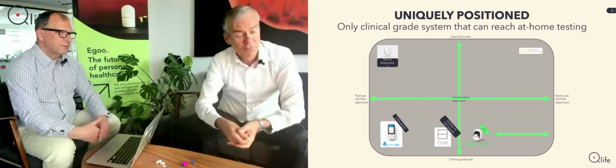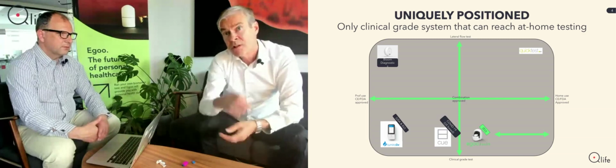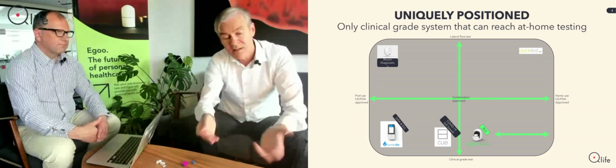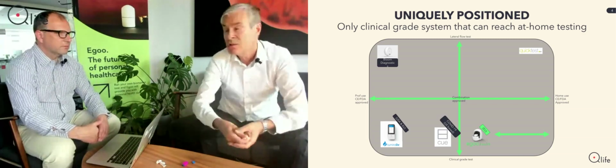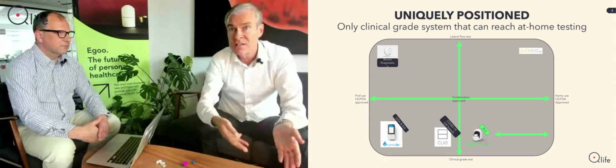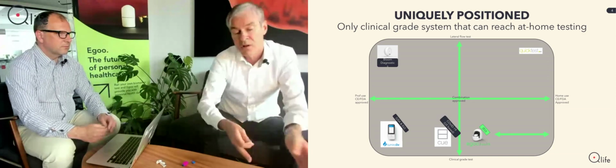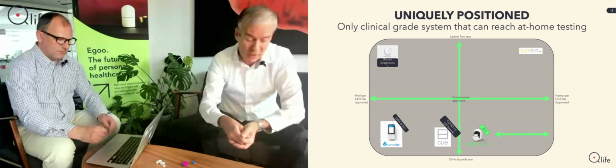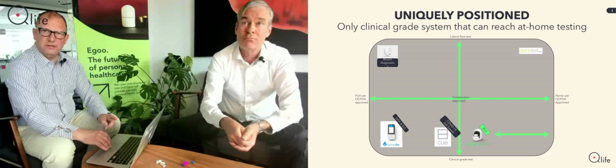What they were really interested to see was, when does the graph level out? Because that indicates when they can start to train again. And for them, it's really important not to get injuries. So in a sports context, this system can be used to tell you when you should exercise and when you should not exercise. Interesting. So, we got the result.